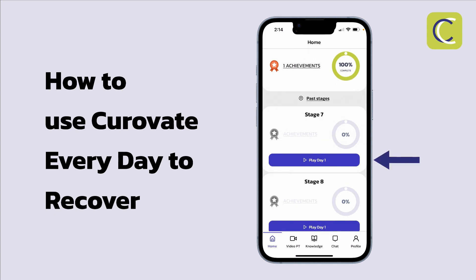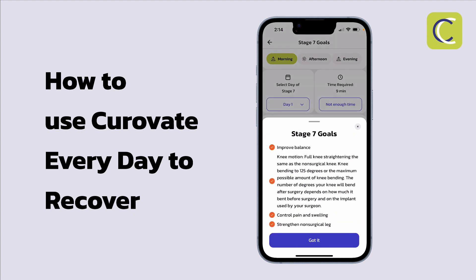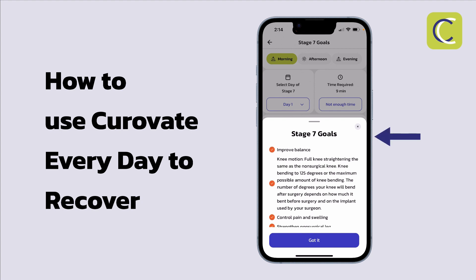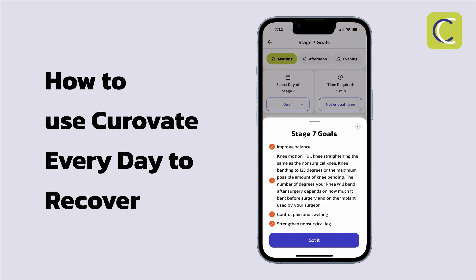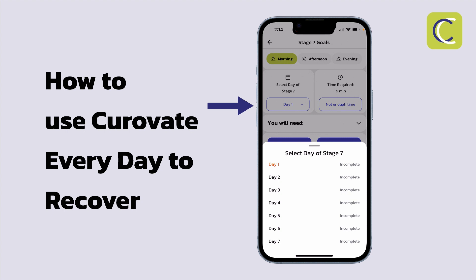As soon as I press play day one for stage seven, I'll be presented with the stage seven goals. I need to read these goals carefully and make sure they are achievable within the next seven days. The reason it has to be achievable in seven days is because each stage inside Curovate has seven days, and right now I haven't yet completed any of the days of my recovery in stage seven.